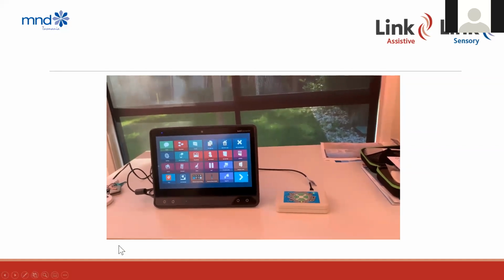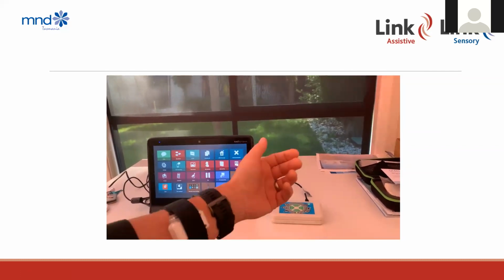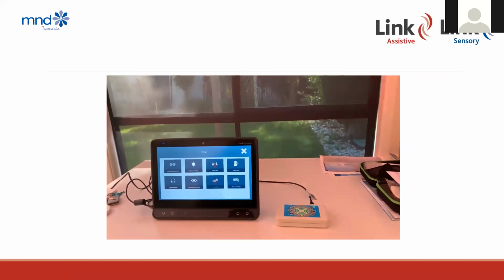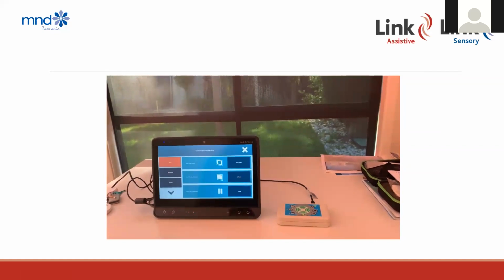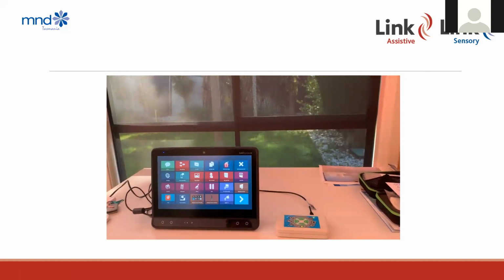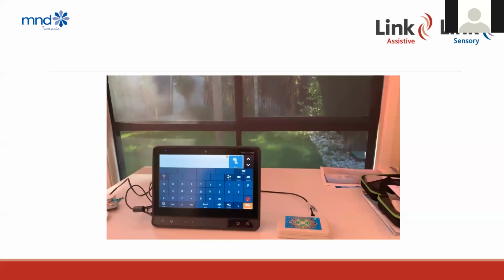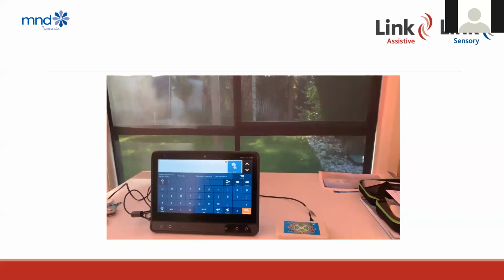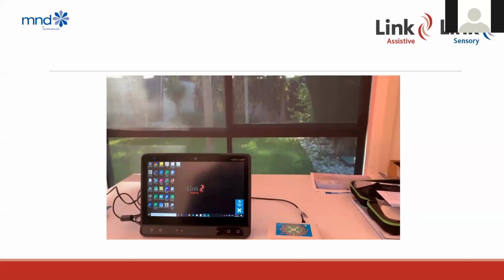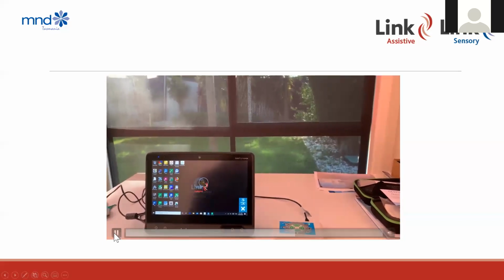All right, the volume does get a bit louder. And I've got the patient unit on my left arm, and in settings here, gaze interaction settings, the activation method is set to switch. So by moving my left fingers, it will just do a single click. So going to speak, close keyboard, missed that, close keyboard. Let's go to desktop and activate computer control. So same thing here, I've set up.